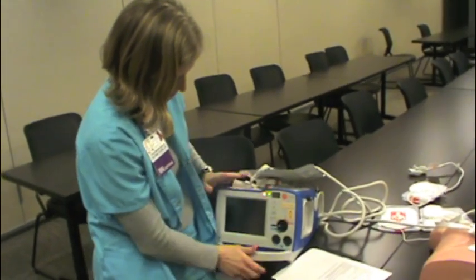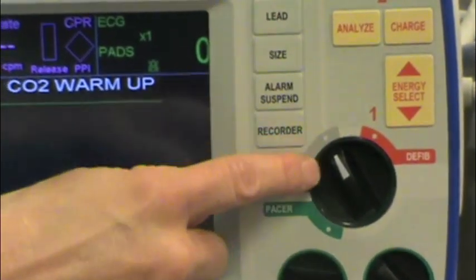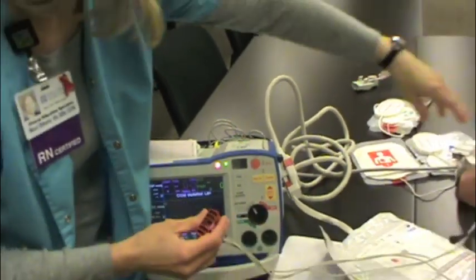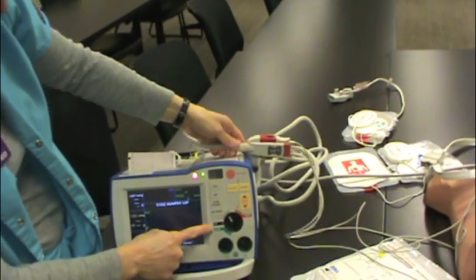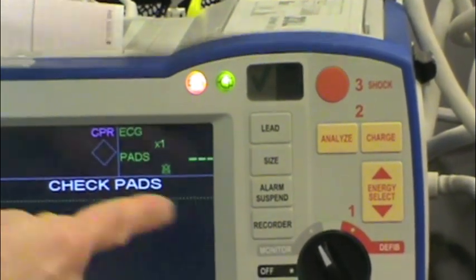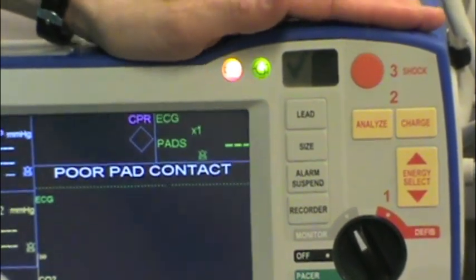Let's go over the other functions on the front of the machine. The main dial has a monitor function. You could use this if you're going to transport a patient and just wanted to use it as a monitor. Instead of using the pads, you would want to use just a 3-lead EKG — that cable is in the little net holder. Some buttons you might need while monitoring are here to change the lead, adjust the gain using the size button, shush your alarms, and print a strip.